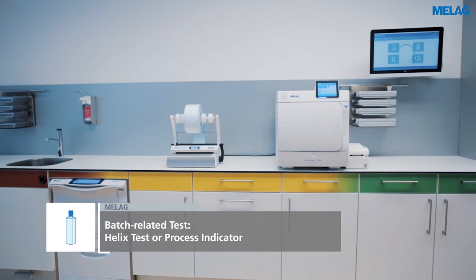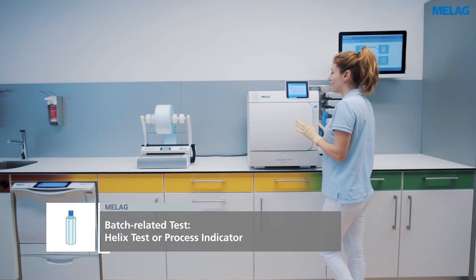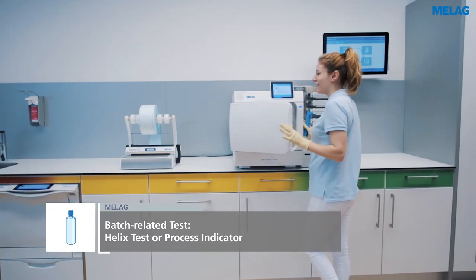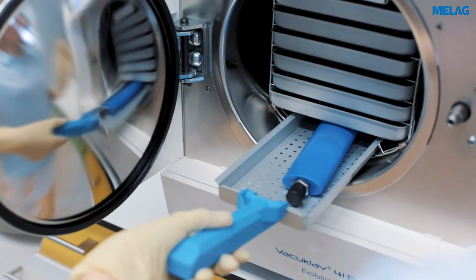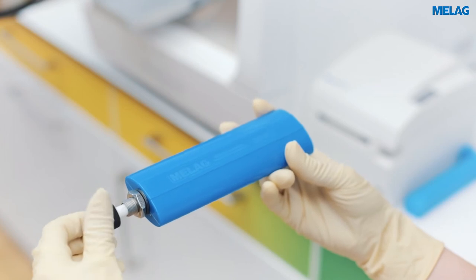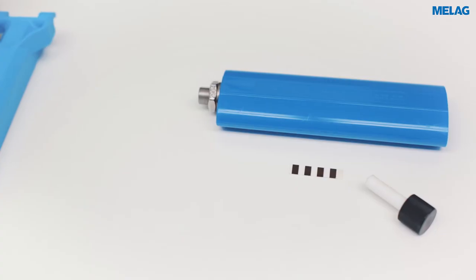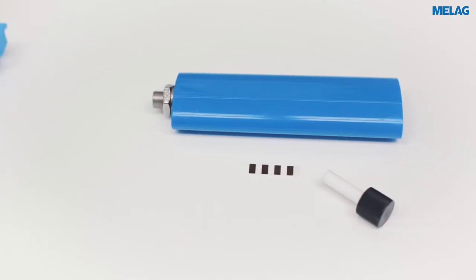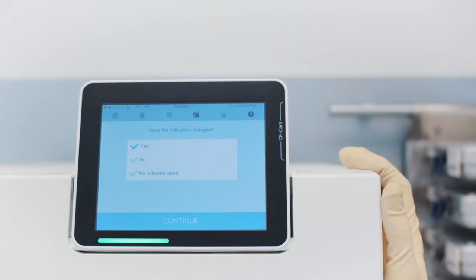The sterilisation batches are checked by using either a helix system or a type 5 process indicator. A Miele control helix test body should be used when sterilising instruments of the category critical A and B. It is not necessary to store the indicator strips. To ensure secure proof, please document only the colour change of the indicator during batch approval.